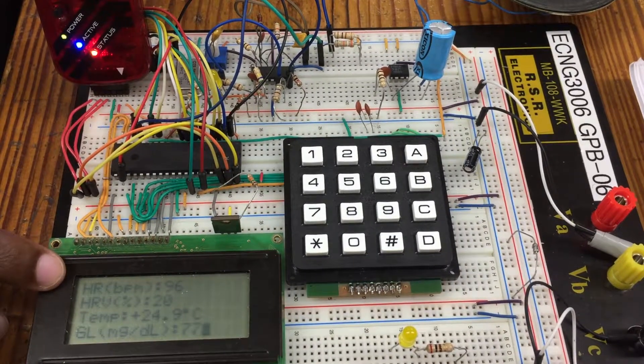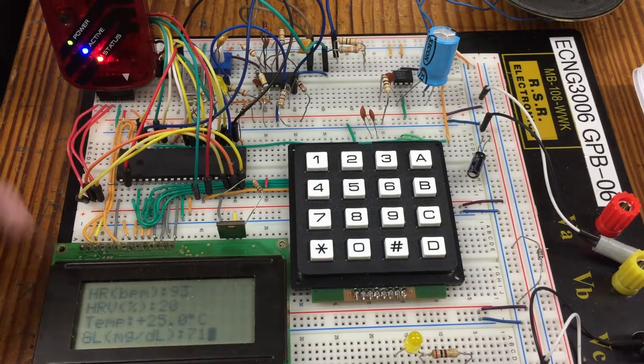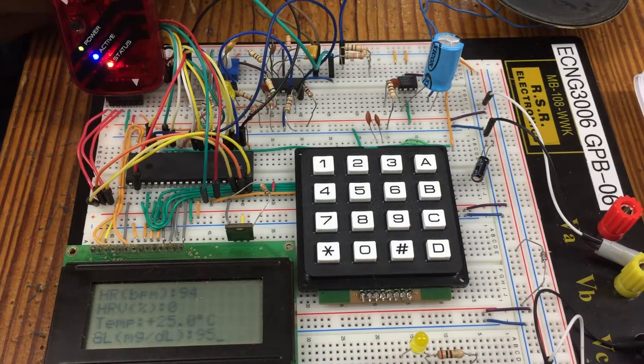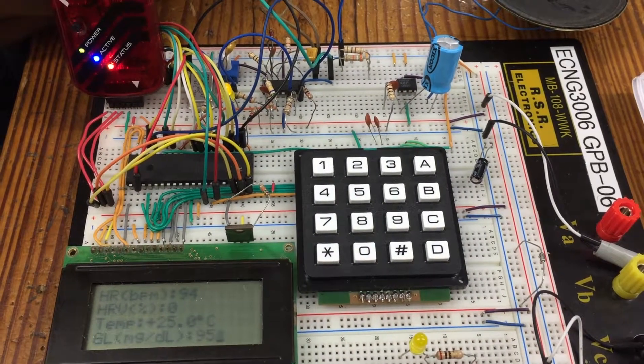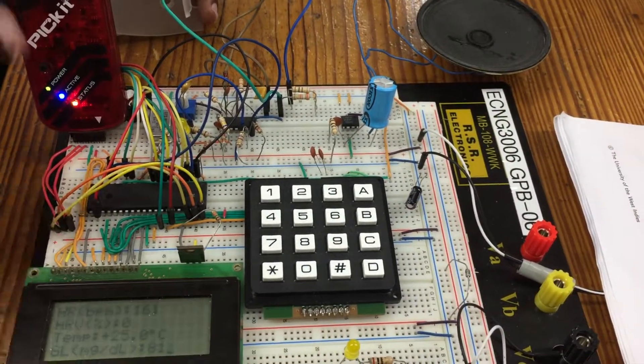So the range for heart rate is between 60 and 140, and 160 I think it is as set. So now we'll test to see if it goes out of the range, what will happen. So I'll just take my finger out and flicker it to simulate a very high heart rate. So you can see it sound the alarm.